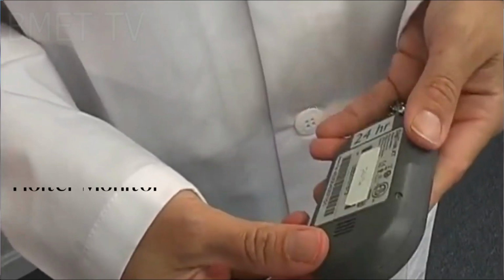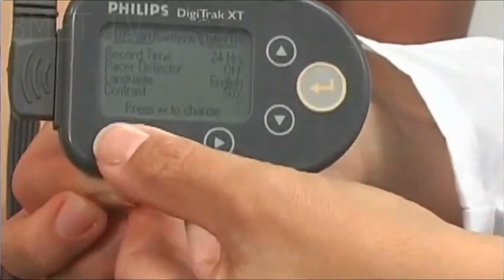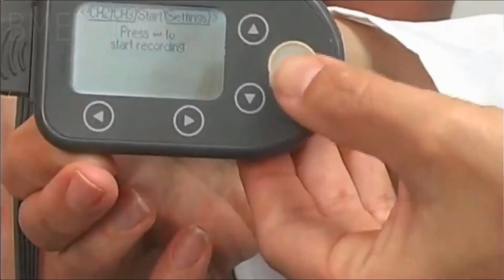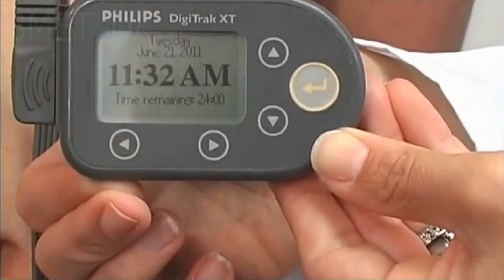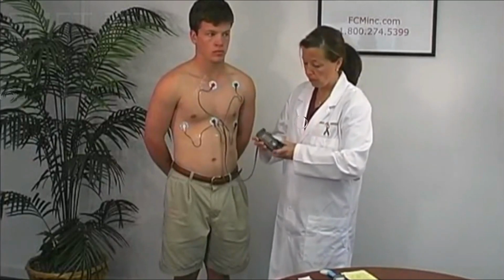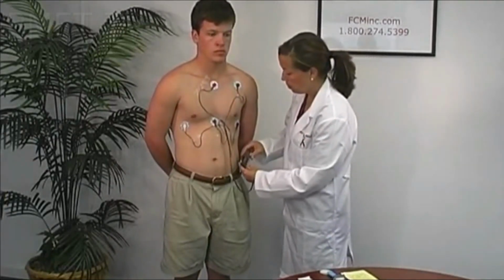The third type of ECG monitor is the Holter monitor. The Holter monitor is a type of electrocardiogram used to monitor the ECG tracing continuously for a period of 24 hours or longer. Electrodes, small plastic patches, are placed at certain locations on the chest, arms, and legs. When the electrodes are connected to an ECG machine by lead wires, the electrical activity of the heart is measured, interpreted, and printed out for the physician's information and further interpretation.